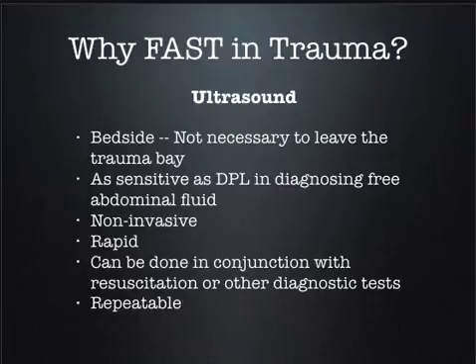Now, you may do a paracentesis, but that's not really a DPL. There's probably nobody in this room that will ever do it, even if you did do it last week in ATLS or whatever. You will never do it, because ultrasound is non-invasive and equally as accurate, and more accurate, and it is certainly a lot more rapid. And ultrasound can be done while you're doing everything else in the trauma bay.